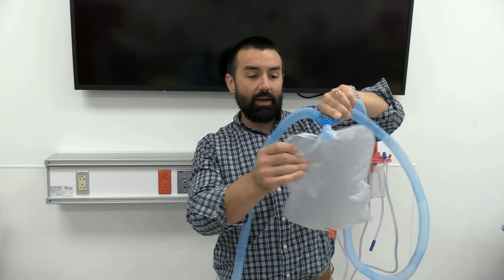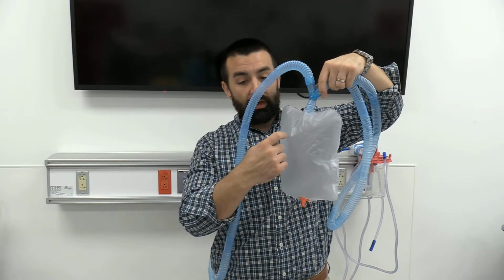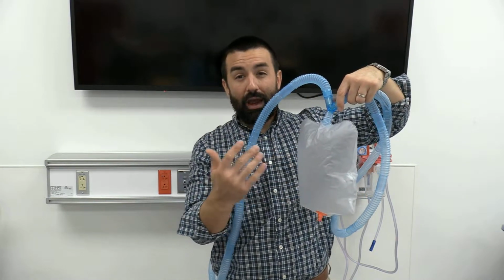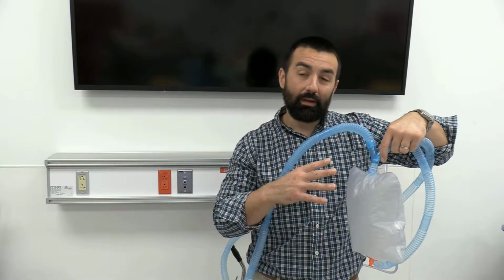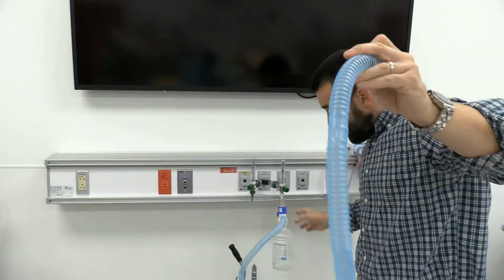Every facility is different. In most facilities I've worked, we'd change these out daily or every 2 days, every 48 hours. So usually if I'm changing it out, I'd initial and put the date that I changed it. I prefer to put the date and time that I changed it rather than the date it needs to be changed, in case the next shift is running behind. You don't want a family member to see something and get upset. Not that we shouldn't be changing these, but trying to look out for your crew is very, very important.